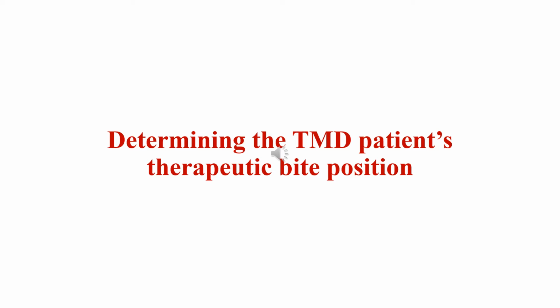We'll be determining or finding the TMD patient's therapeutic bite position, the therapy we're going to be using for the diagnostic appliance. They're going to bite, B-I-T, like I bite you in the leg. They're going to bite into this appliance, and the appliance is going to fit into the upper teeth so they actually have a bite. The brain doesn't know that that's plastic.